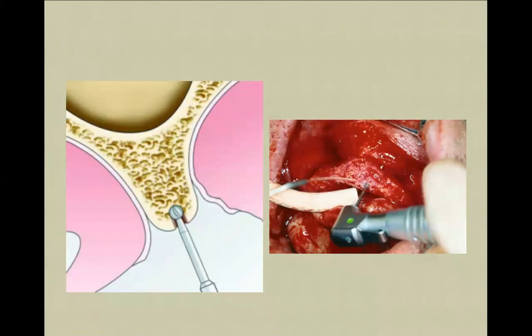So 4 millimeters from the crown of the existing tooth to the central axis of the implant, that is this hole, or the distance between 2 holes, which indicate the central axis of the implant, not less than 7 millimeters.